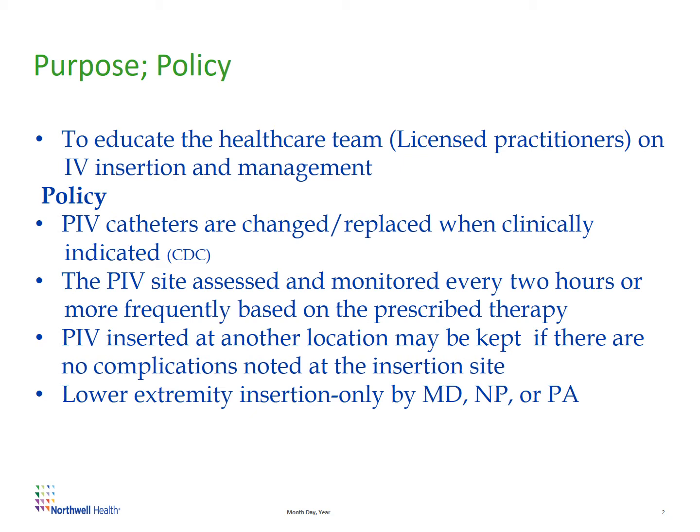The peripherally inserted IV site assessment and monitoring is done every 2 hours or more frequently based on the prescribed therapy. For example, for blood transfusions, you may have to assess and monitor the site more often than 2 hours, and same goes with the chemotherapeutic drugs.